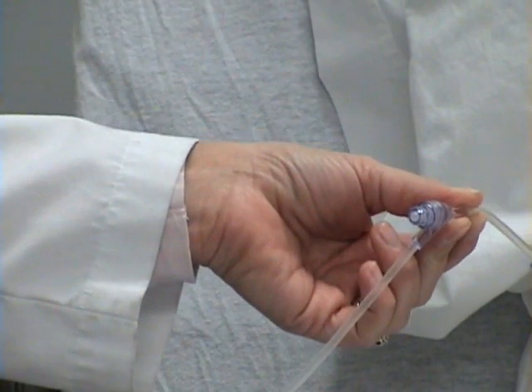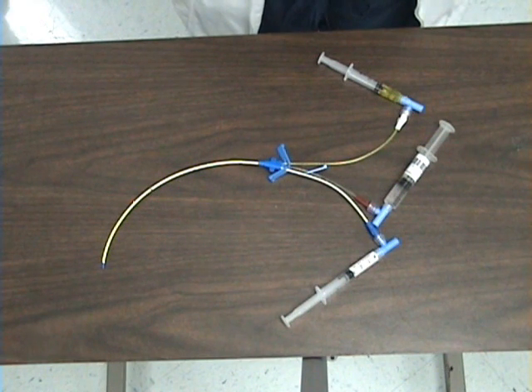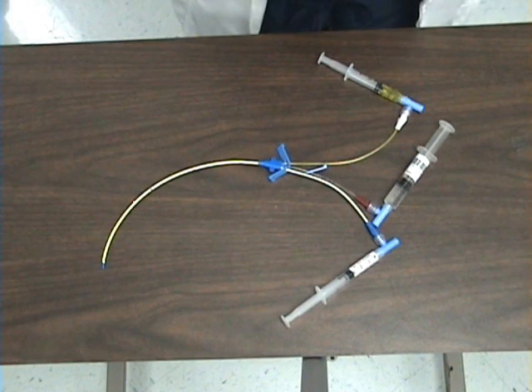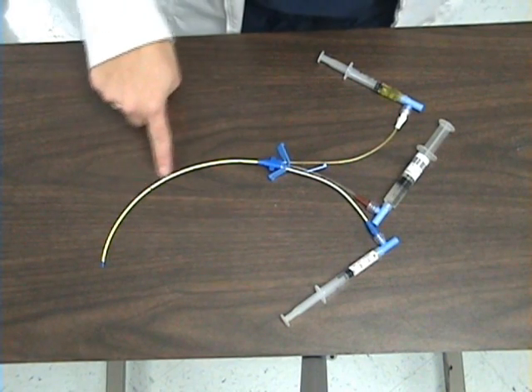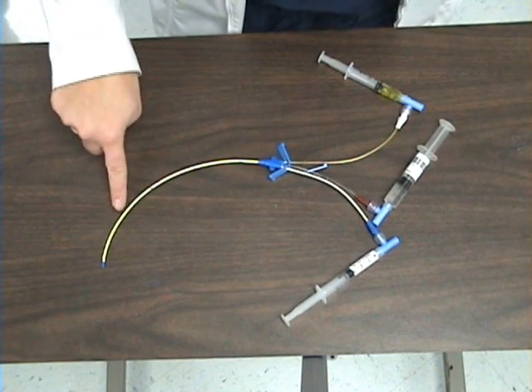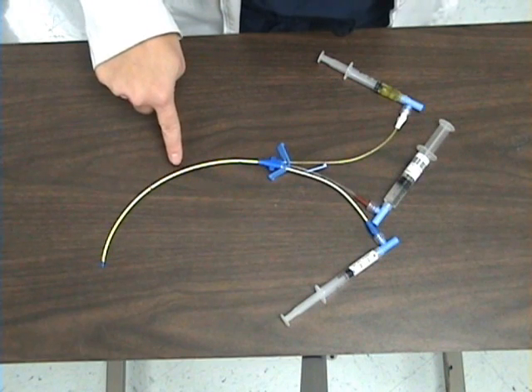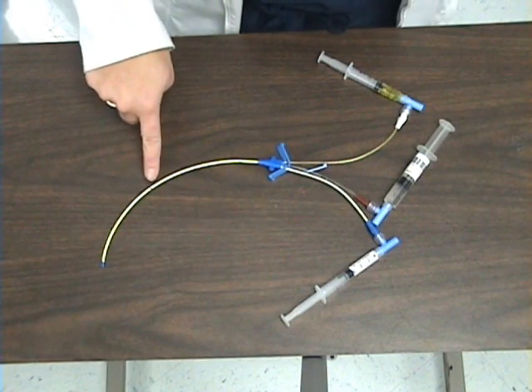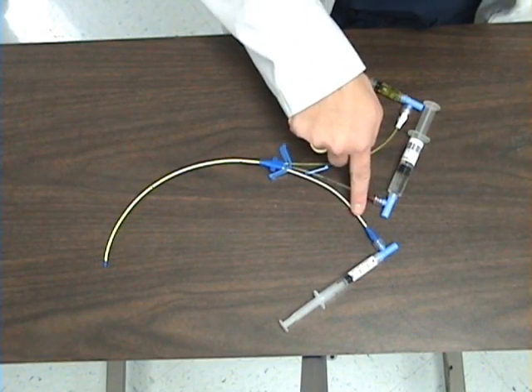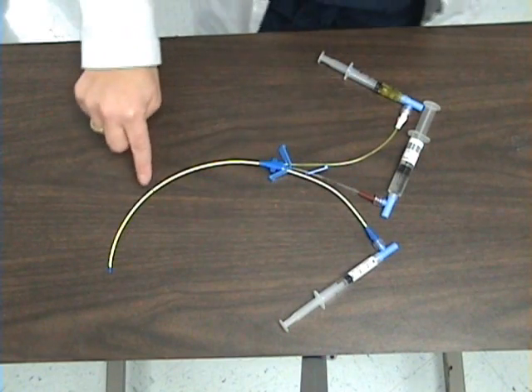Note that this is a central line triple lumen catheter. There are also double lumen catheters and single lumen catheters. Here you see the catheter which looks like one tube or one lumen — this is the portion that is in the patient's vessel. Within this one tube or lumen, there are three separate individual tubes or lumens. Each of the lumens has a separate exit portal.